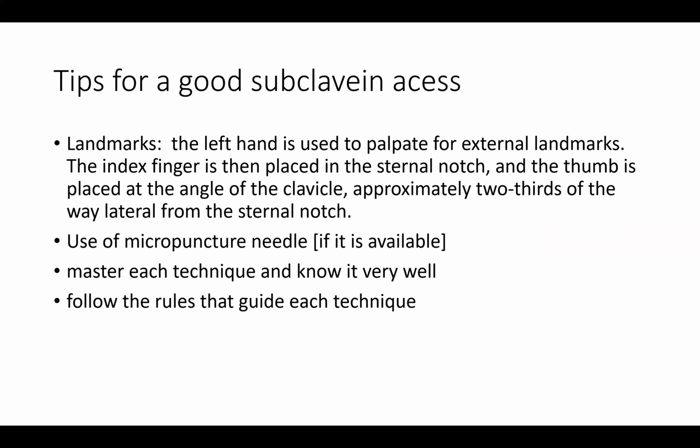So what are the tips? Before we discuss the tips, there is one I talked about: using coronary wires. If you set a line at the cubital level or the brachiocephalic vein, you can actually pass a coronary wire through that line, and it traverses all the way, and it gives you a way to look at the direction of the vein, because the coronary wire can traverse through there and get to the right side of the heart.